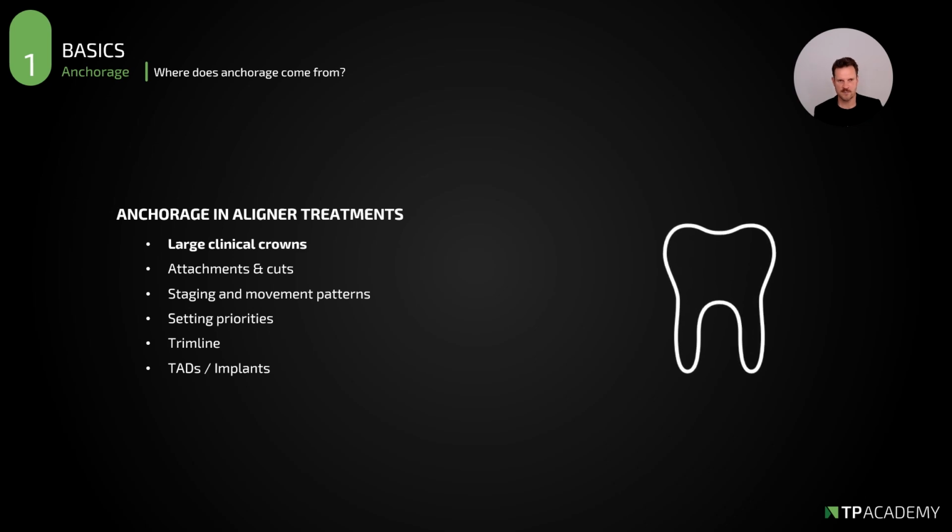Anchorage in aligner treatments. Number 1, large clinical crowns. It's very easy. The bigger the clinical crown, the more anchorage. I have the undercut.